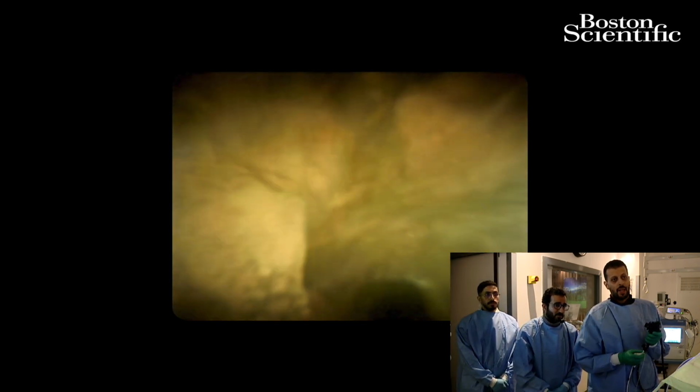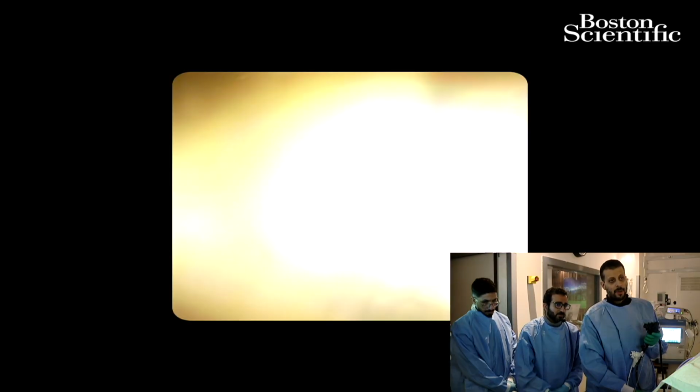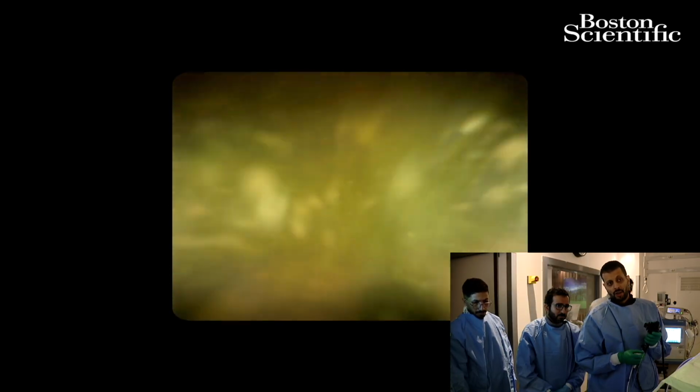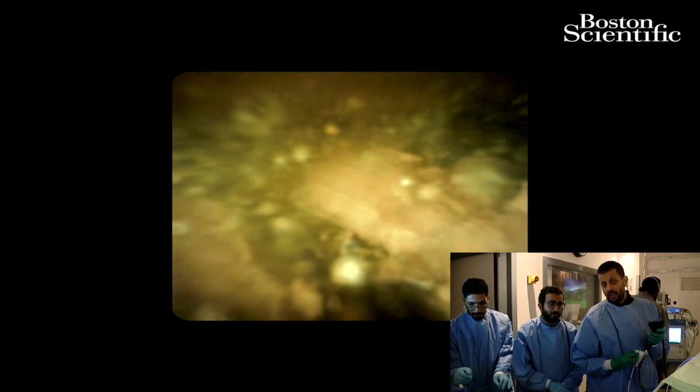So hopefully now, when we advance the balloon and try to sweep, we'll try to sweep the distal debris first. And then we'll try to remove these fragmentations of the stone. Now it's very important that these patients get antibiotics and that they're intubated because of the amount of water that we're using in the bile duct. So antibiotics, intubation, and then we leave them with a stent.